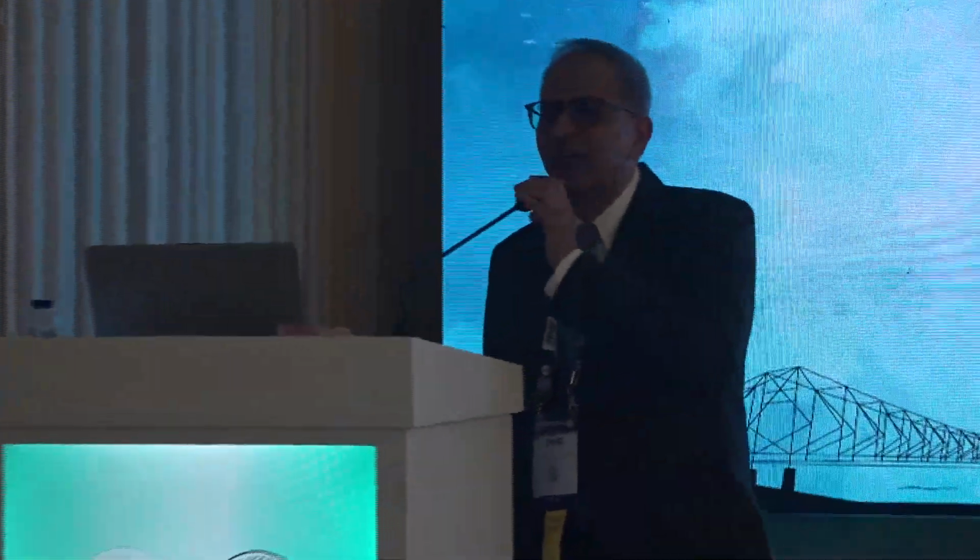And another take-home point, as has been shown by Dr. Saurabh and all, whenever you do vitrectomy, you have to suture them up, and the way he applied trypan blue to see whether there is any leakage or not. Because if there is any leakage, that can be catastrophic. So all incisions have to be totally sealed.